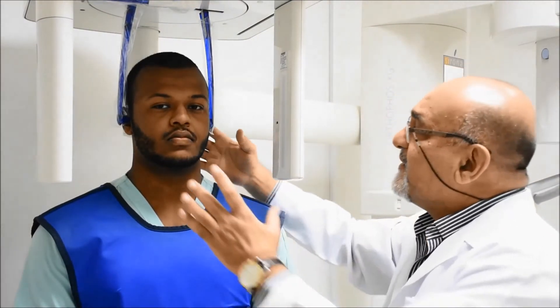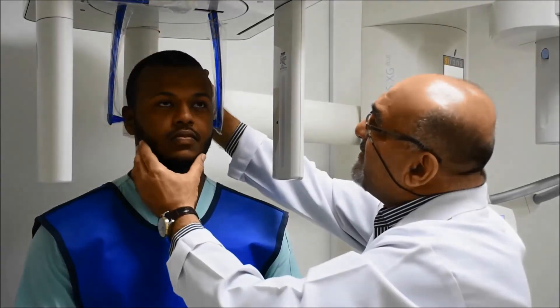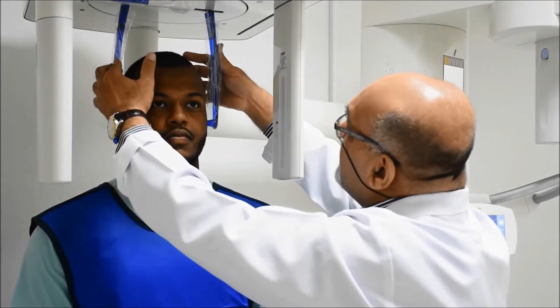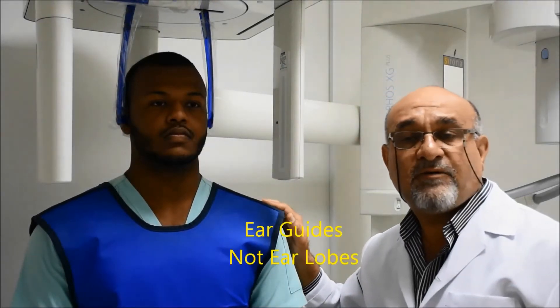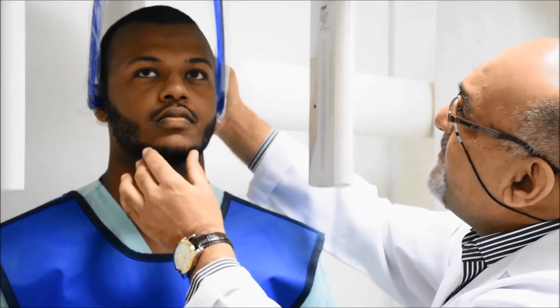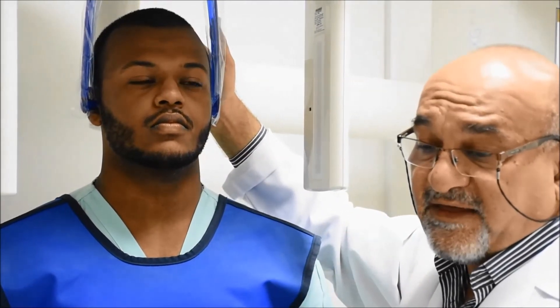Sometimes patients don't close in on both sides simultaneously. When fitting the ear olives, look inside to make sure both sides have gone into the right and left external auditory meatus. This will stabilize the patient and prevent movement to either side.